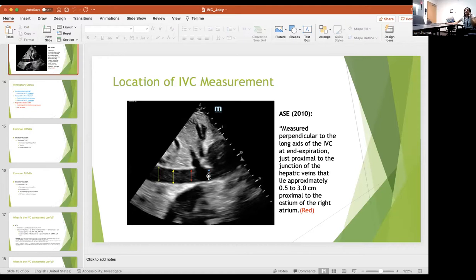I just wanted to say thank you for letting me observe today's presentation. It's extremely helpful. And I had a question for the group, in terms of the curriculum that you guys have developed. Are you advising the residents and the learners to go based on 4 centimeters from the right atrium at this point when they do their measurements as a standard of care?